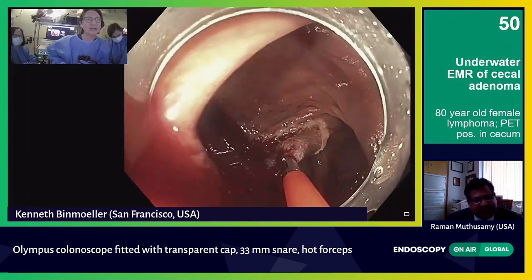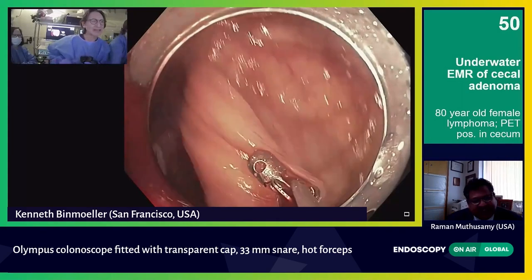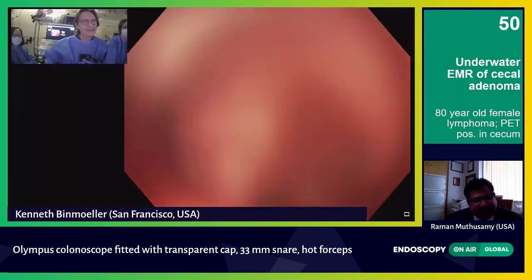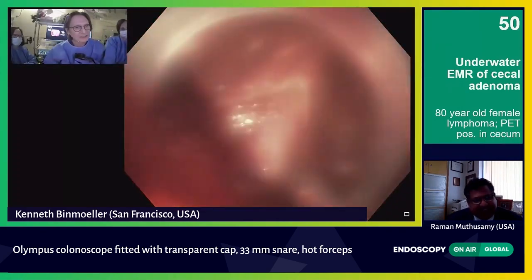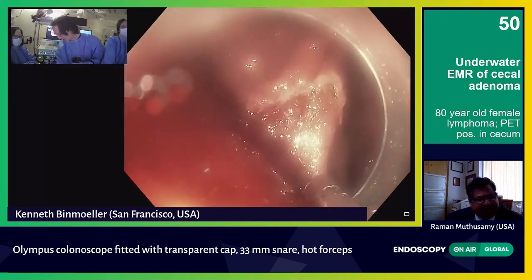Let's try now. Here we go — just wait a little bit until it's open. I think that's enough. Close. Now I'm just going to quickly suck out some of the blood here, and then I'll rinse off.